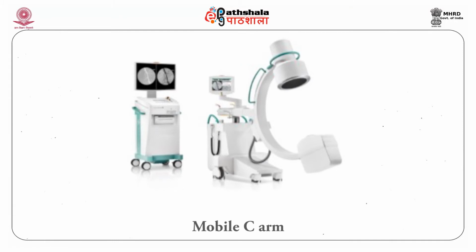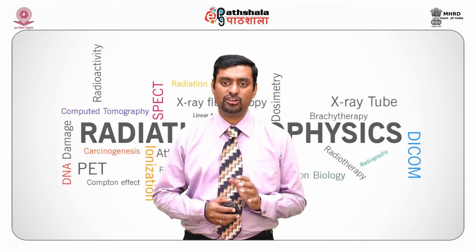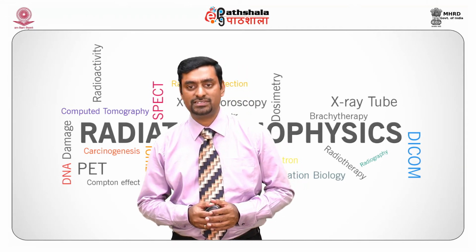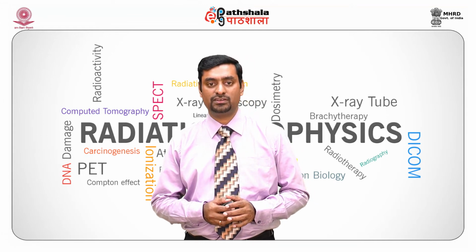That's how a mobile C-arm looks like. We have seen the image intensifier on top and the X-ray tube below. That's called an undercouch X-ray tube C-arm machine. This kind of machines usually have a stationary anode X-ray tube and can be used for orthopedic and urological surgeries.